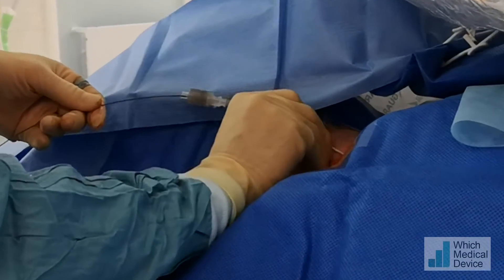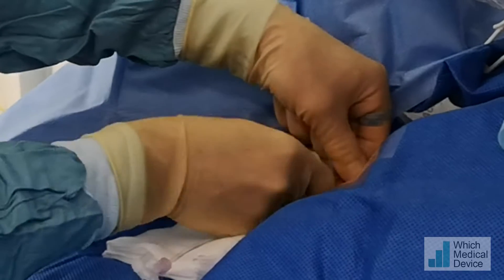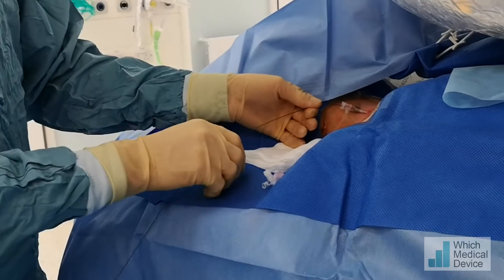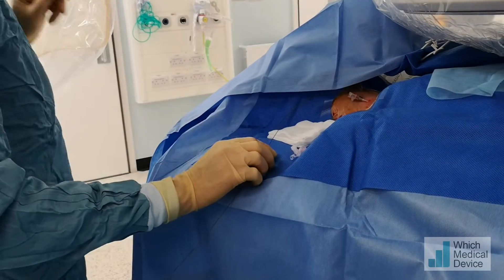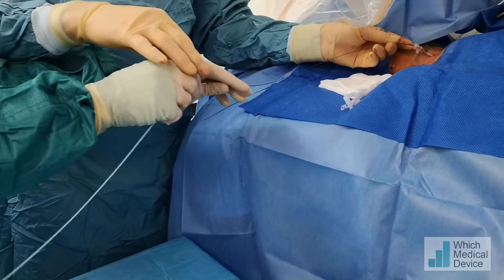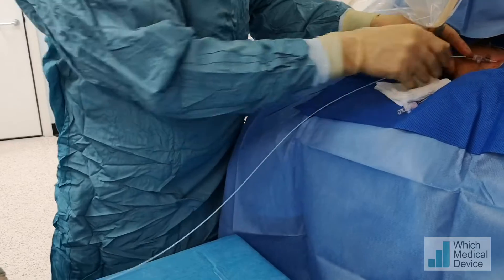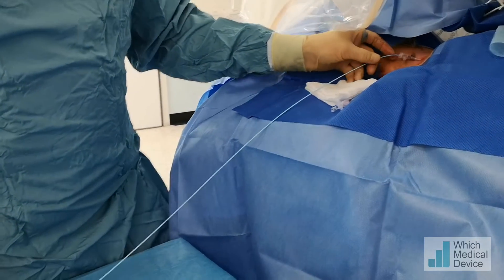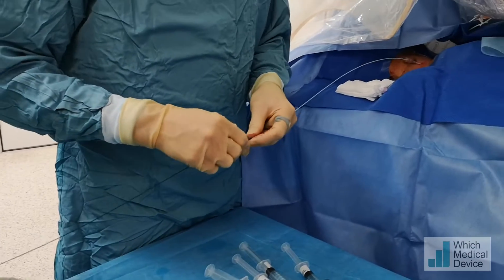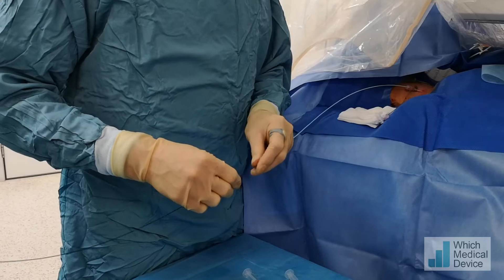A bit of pushing in the neck now. Let's have the multi-purpose catheter on, please. I'm just going to put my lead screen in. This is a standard multi-purpose catheter, which has a very useful angle just for getting into the left renal vein and then the left gonadal vein. We're just going to use a hydrophilic wire to get us down out of the right atrium into the IVC.